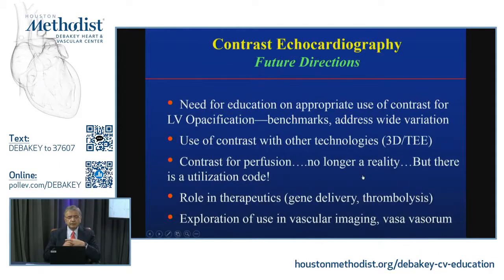So, in conclusions and future directions, bullet number one, I think we've done much better. We've been in this field for years, and education is permeating various laboratories, and the appropriate utilization of these technologies has really increased over time. I'm confident that most people would use these contrast agents appropriately in the indications that we talked about, which really can enhance the quality of the studies as well as the interpretation, which has important clinical implications for therapeutics and further diagnostics and many other things.